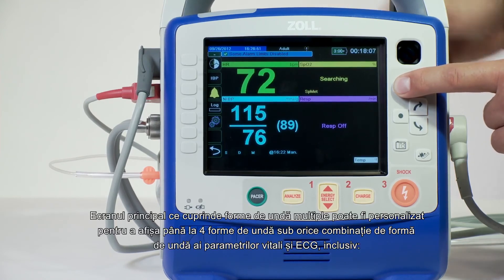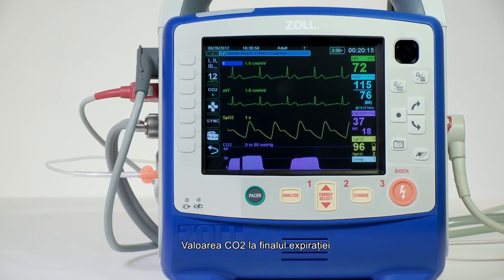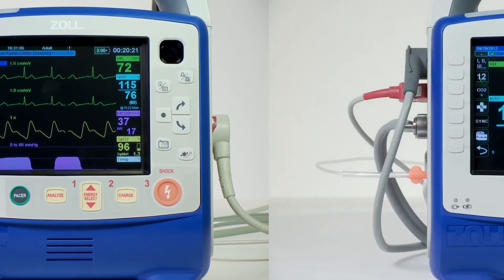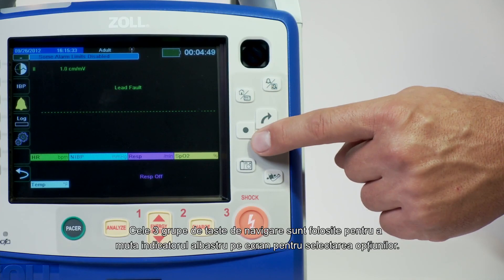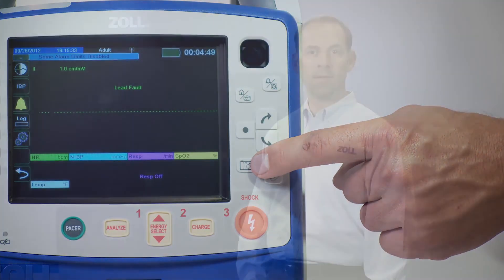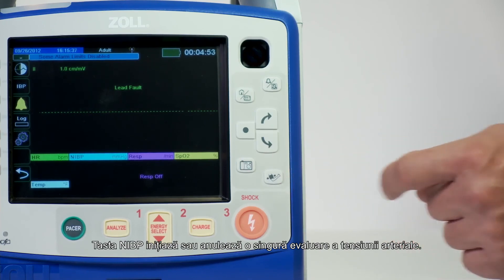The multi-channel home screen is custom configurable to display up to four traces — any combination of ECG and physiological waveforms including end-tidal CO2, pulse ox, invasive blood pressure, and real-time CPR feedback. The large numeric screen shows enlarged numbers for improved visibility. The three-key cluster of navigation keys is used to move the blue indicator on the screen to select options. The snapshot key captures 24 seconds of data — 12 seconds prior and 12 seconds after the key is pressed — giving you the ability to go back 12 seconds in time to capture significant events. The NIBP key initiates or aborts a single blood pressure assessment.